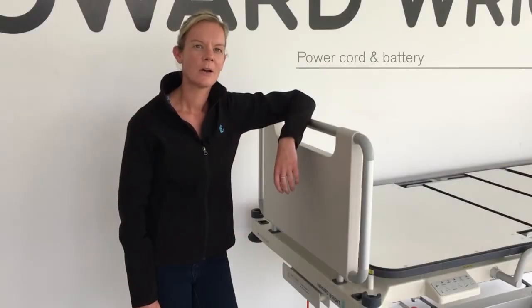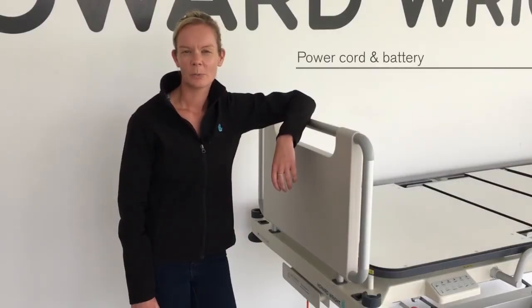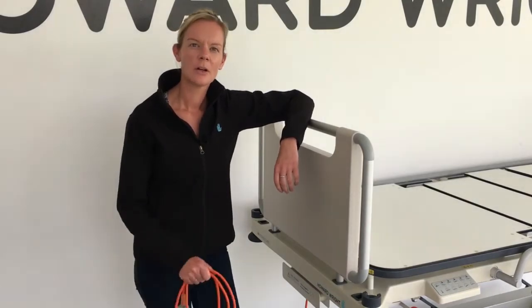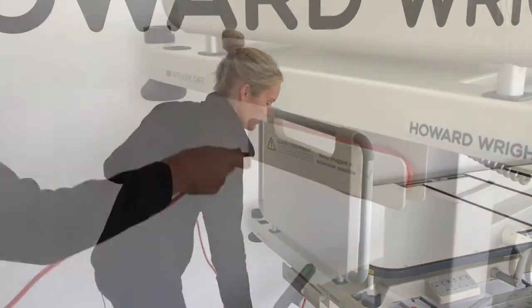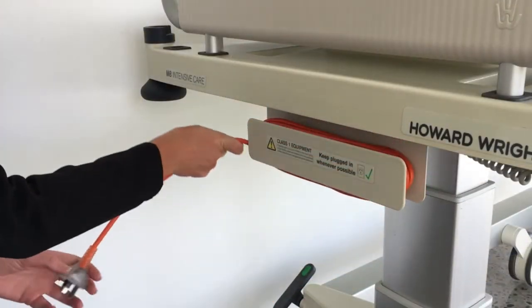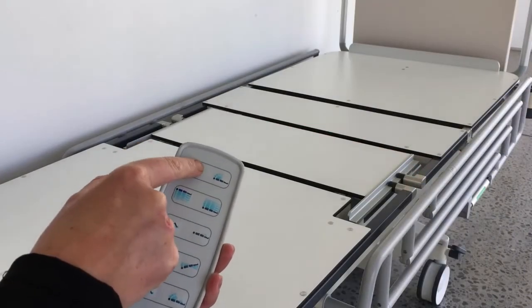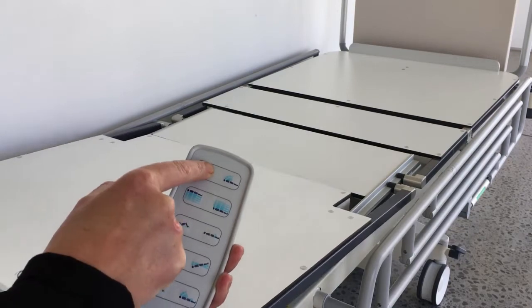The bed has a power cord at the head end and should be plugged in whenever possible for optimum performance and to charge the battery. When the bed isn't plugged in, the power cord should be coiled around the cord holder. When the battery runs low, a beep will be heard when a function button is pressed, and the bed should be plugged in to charge the battery.